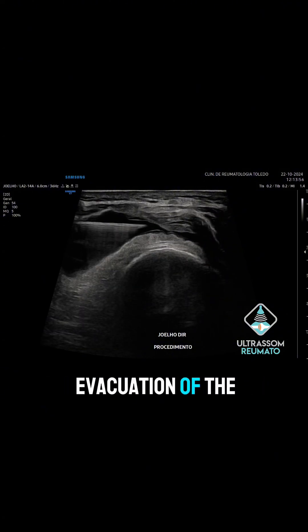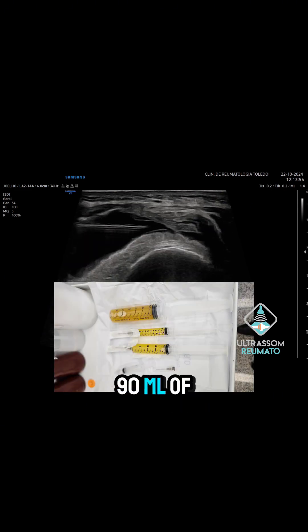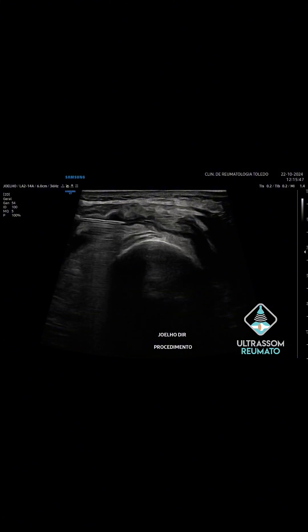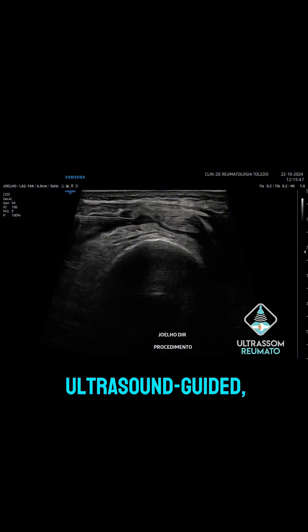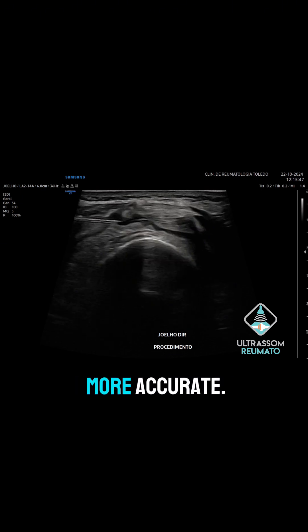Note the complete evacuation of the suprapatellar effusion after the removal of approximately 90 mL of synovial fluid. The procedure was ultrasound-guided, facilitating proper needle positioning and making the process safer and more accurate.